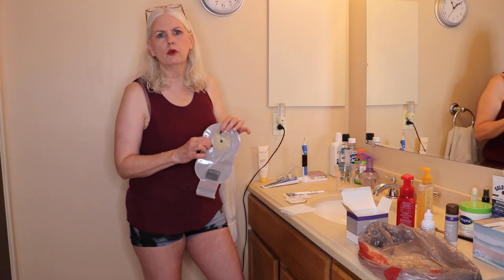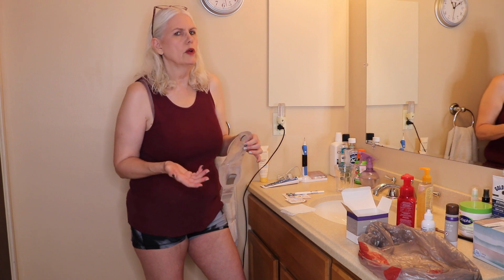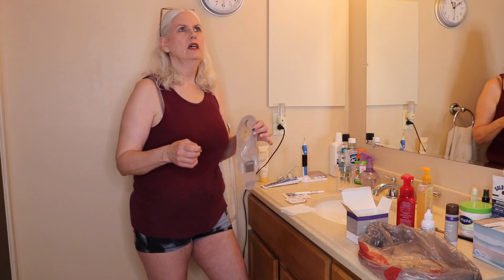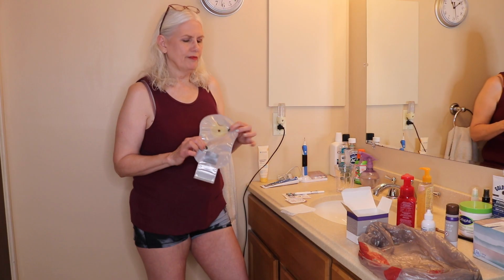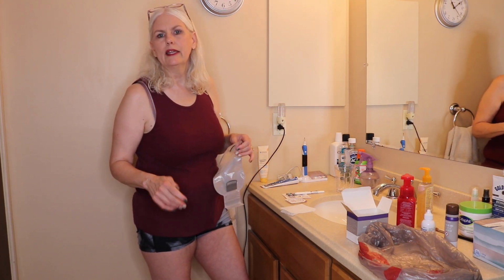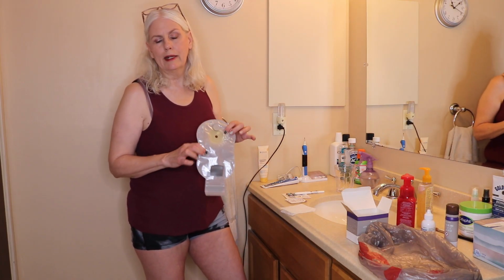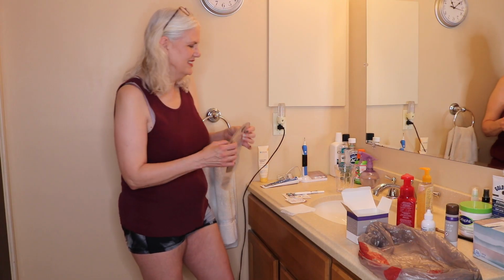Some of the benefits of the see-through for me are just in case you are having any problems with any output, or for me, like when I was going to have my colonoscopy, I wanted to see what was coming out. And granted, all of you with regular butts that go the regular way, you just have to look in the toilet and see. But I've got the advantage of I can look in my bag and see how it's coming out, what it's looking like, what color it is.